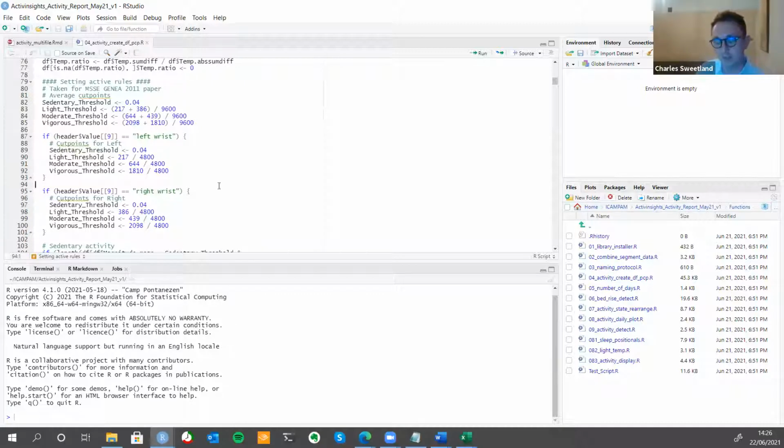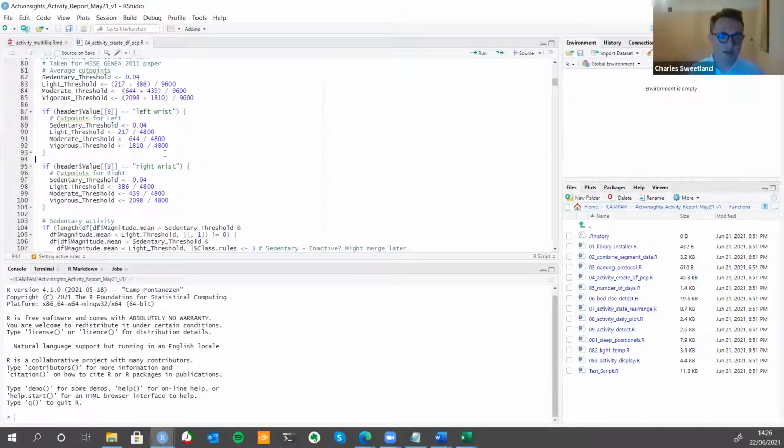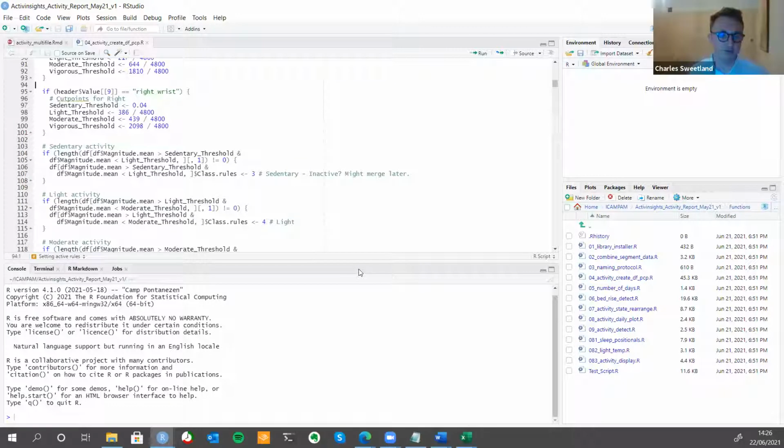We've got this paper set up, and we will be taking the cut points from this paper. But in terms of our sleep, inactive, and non-wear classification, you can find those cut points further down. Yeah, I think that's what I need to say. We've got 2 projects at the moment looking at non-wear and to validate those. What we found works quite well is we put up an algorithm that can be publicly referenced, that's accessible, and then we can work with researchers to validate and optimize those. That's the process that I think we're keen to continue.